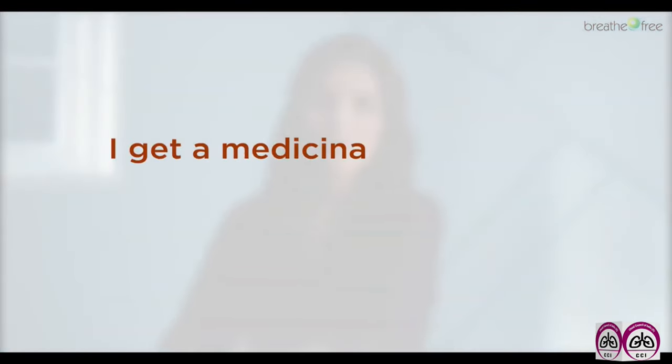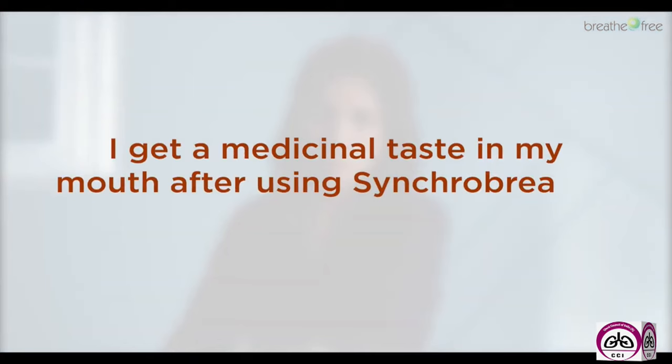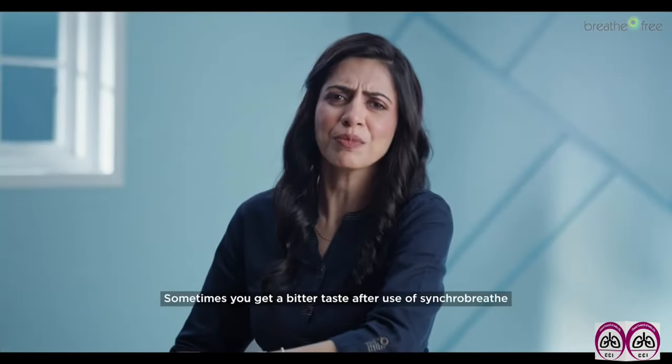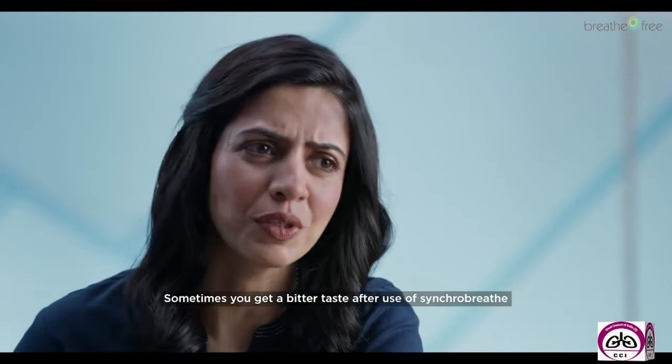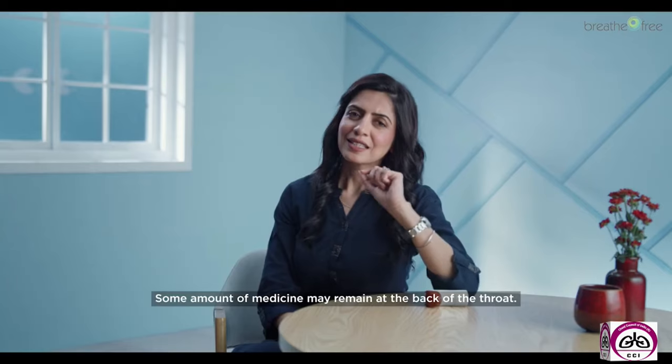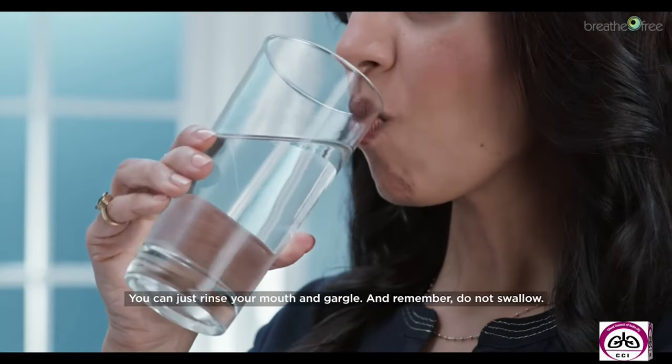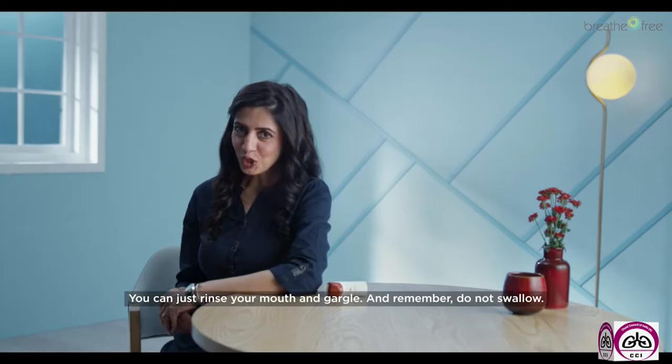I get a medicinal taste in my mouth after using SynchroBreathe. Is there a reason for concern? Yeah, sometimes you get a bitter taste after use of SynchroBreathe, which is absolutely normal. Some amount of medicine may remain at the back of the throat. You can just rinse your mouth and gargle. And remember, do not swallow.